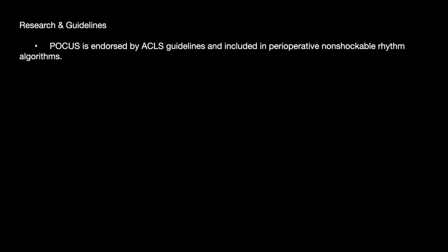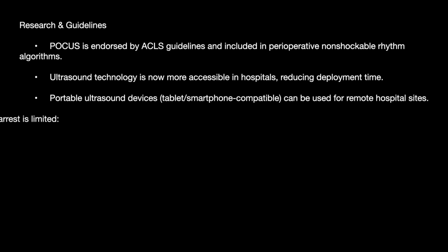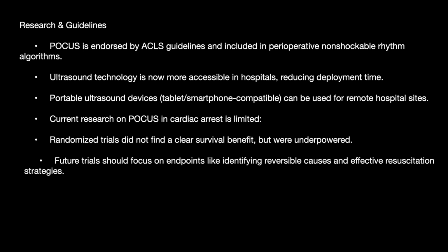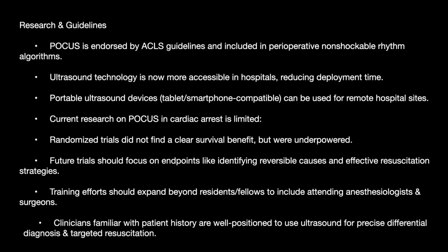On future research and guidelines, POCUS is endorsed by the ACLS guidelines. Ultrasound technology is more accessible now in the hospital. Portable devices are easily found. Current research should focus on randomized trials, which have been underpowered, so we need better powered trials. Future trials will focus on endpoints, identifying reversible causes and effective resuscitation strategies. Training efforts should expand beyond resident fellows to include attending anesthesiologists and surgeons.